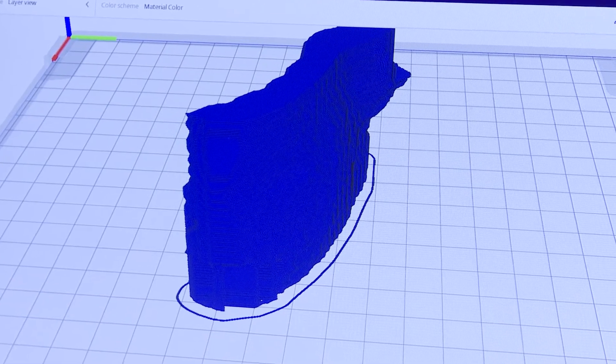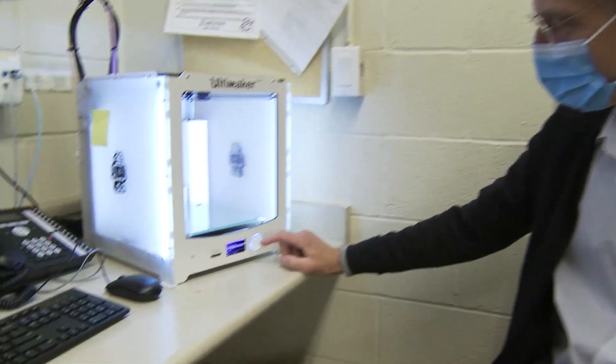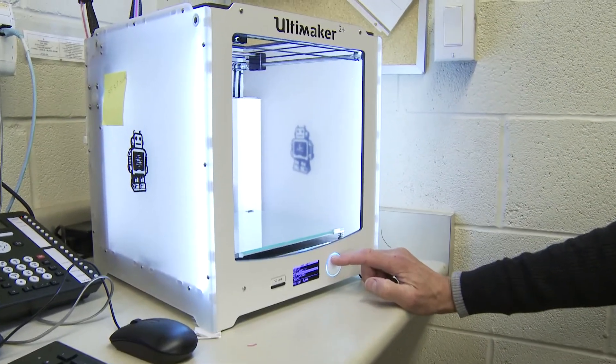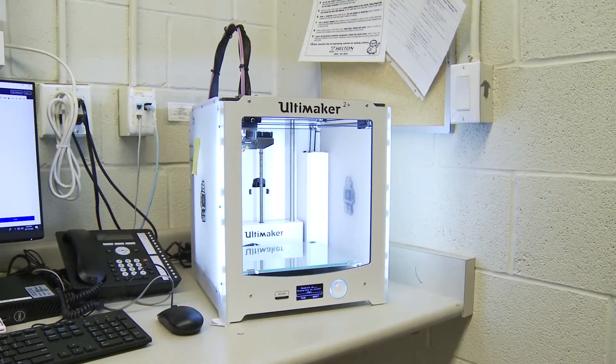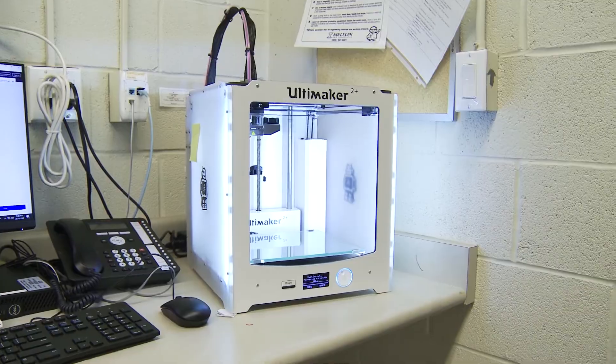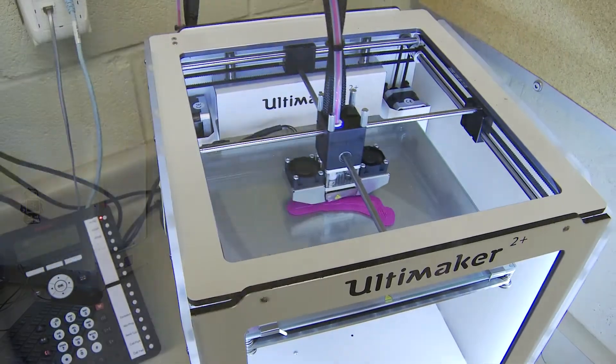The design of the bolus is taken from the computer and put on a flashcard, and using the menu on the front of the screen, I can just select the bolus for printing. It's going to take a little while to warm up. The nozzle is heating up to the temperature at which the PLA will melt — between 195 and 240 degrees Celsius. At the same time, the build plate is getting hot, and that will allow the plastic to stick to the build plate.